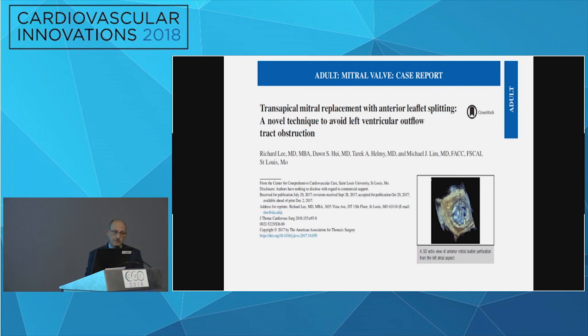A couple of questions, great example there. So when you're ballooning, what size is the balloon? We usually use between 18 and 20 millimeter aortic valvuloplasty balloon.